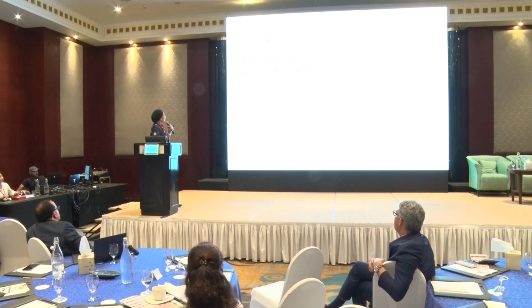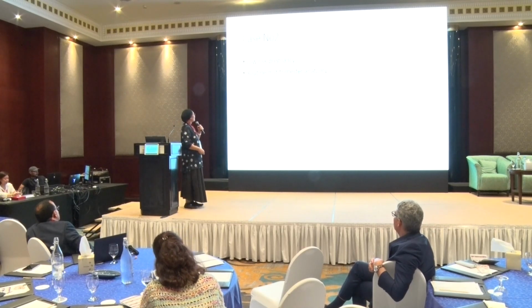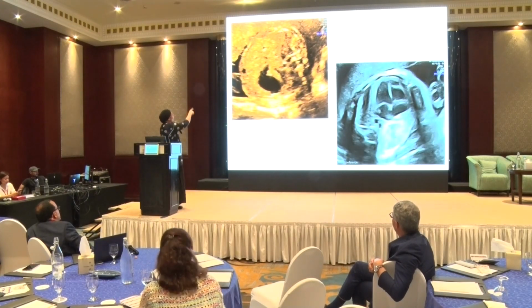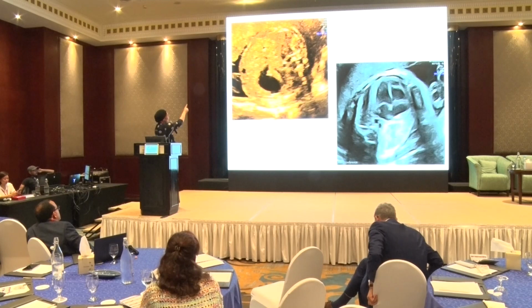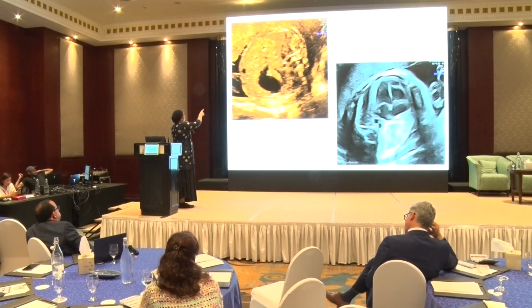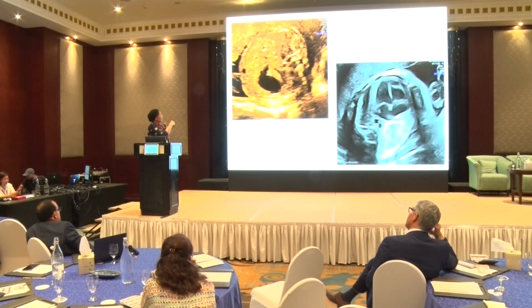So the next scan, the patient, it's a completely low-risk pregnancy, routine mid-trimester anatomy. And again, I will leave it to your imagination. That's the situs that we are trying to establish, abdominal situs. The stomach is in the normal orientation. This baby was cephalic, and you can see the clockwise orientation. What else is there that is abnormal? I can give a clue, and it was already shown by Dr. Diana in the morning. What is that?